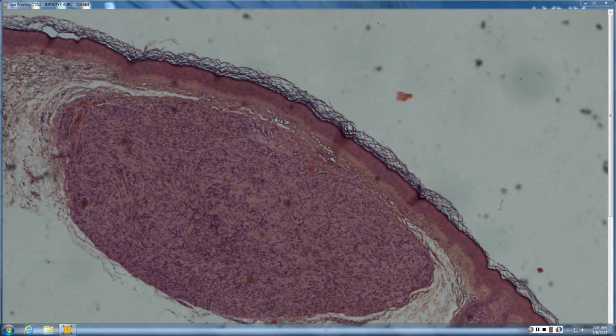So, kind of a starry night pattern a little bit. So, I think it's sclerotic fibroma, perhaps. Are sclerotic fibromas hypercellular or distinctly hypocellular? And this one is more hyper. I mean, it almost has a herringbone pattern too. So you might think something fibrohistiocytic.